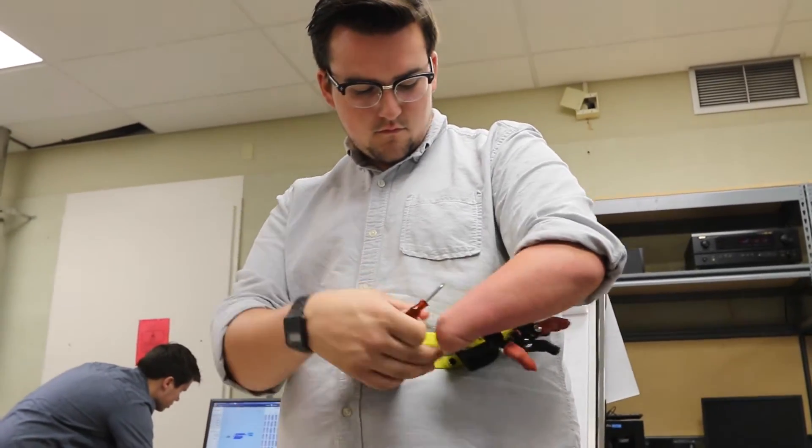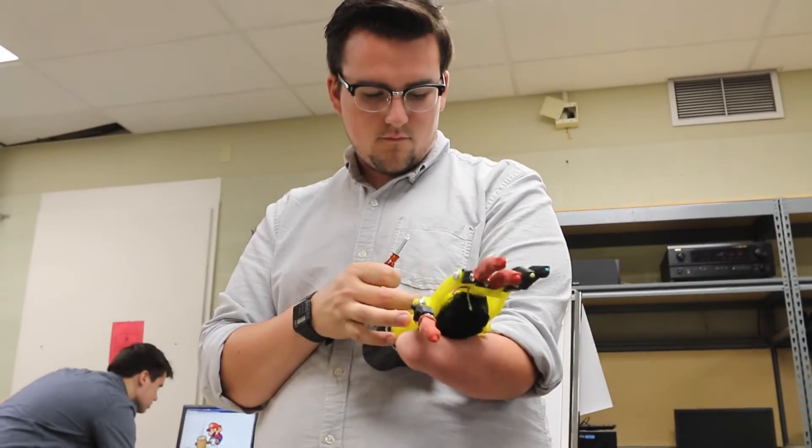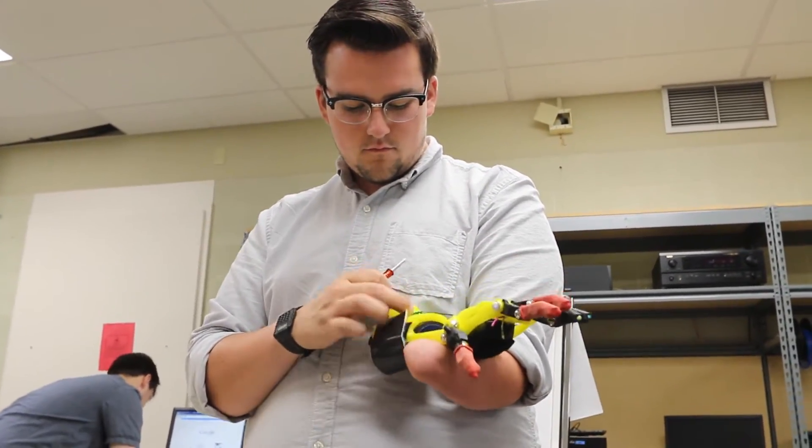It just takes a screwdriver and your patience. We print all the materials with 3D printers — a lot of it was actually printed here at the Makerspace. There are two fingers that are carbon fiber, just to test the material out, and then two fingers and the thumb are ABS plastic, which is the most common plastic used to build Legos. The gauntlet and the palm are both PLA, which is a biodegradable corn plastic. Everything else underneath is Velcro with duct tape and a mouse pad.